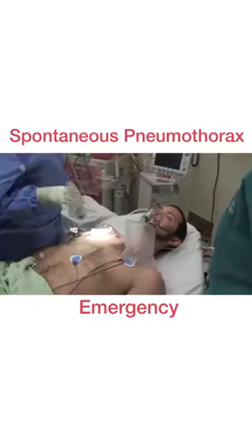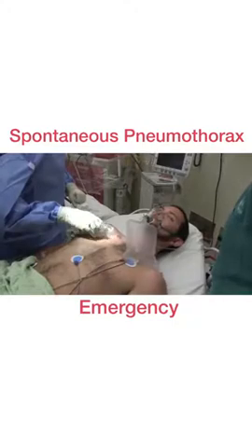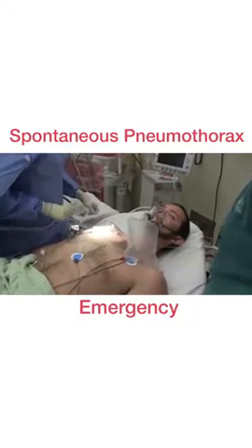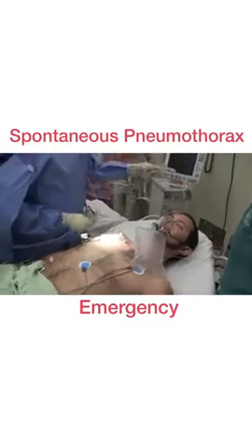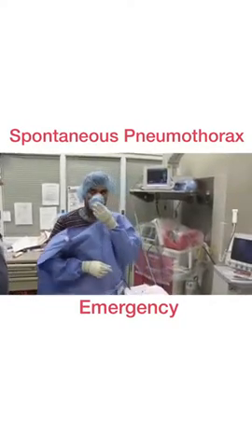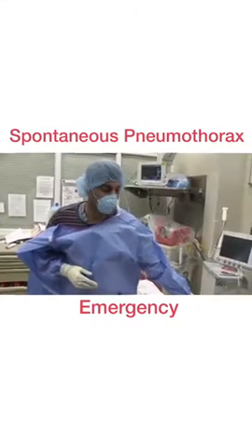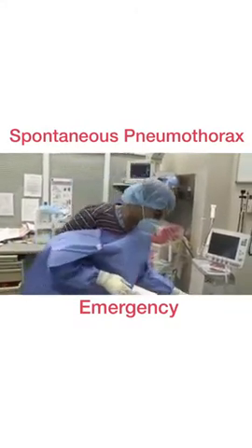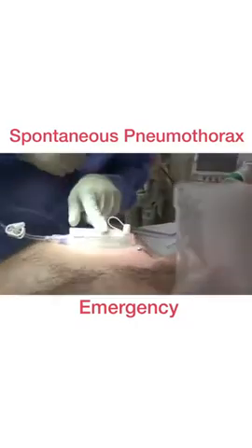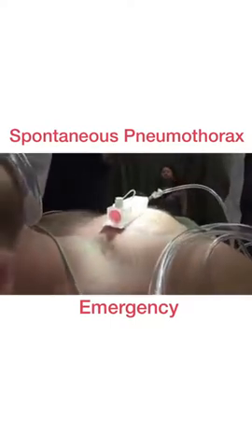So this is slowly going to improve that area, okay? And that's collapsed, and we're going to get a chest X-ray to compare in just a little bit. So the next step is to get a confirmatory X-ray and then to repeat another X-ray in about 30 minutes' time. Then we continue to watch the patient for any complications. And you can actually see the fluttering of the little flutter valve here that will indicate that you're essentially in the thoracic cavity.